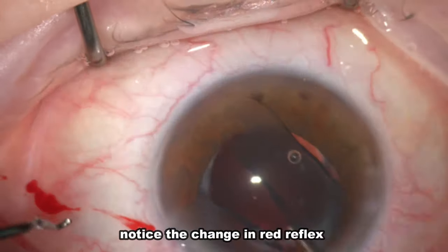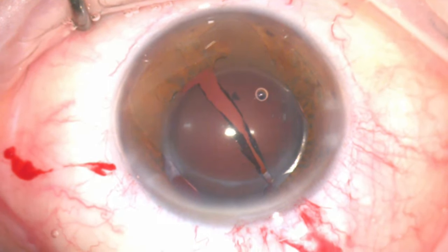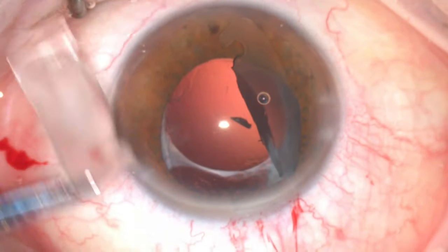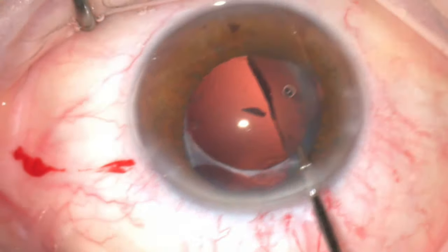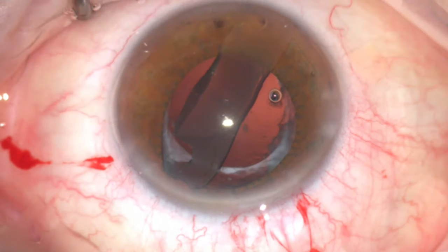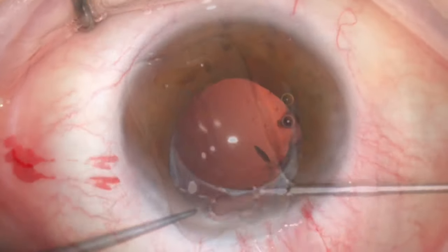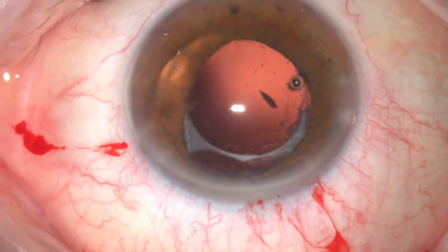You can notice the change in the red reflex since the patient was quite symptomatic from such lens opacification. The first half of the lens was grasped from the edge by the micro-forceps and gently squeezed from the main incision outside the eye with the help of notched forceps. Once explanted outside the eye, it is always a good idea to check carefully for any missing lens fragments. The other half was slightly rotated to bring its edge along the axis of the main incision, then after injecting some visco-elastic into the anterior chamber, the second half was grasped by the micro-forceps in the same way. The two halves were rechecked and you can notice the level of lens opacification and the remarkable difference in red reflex.